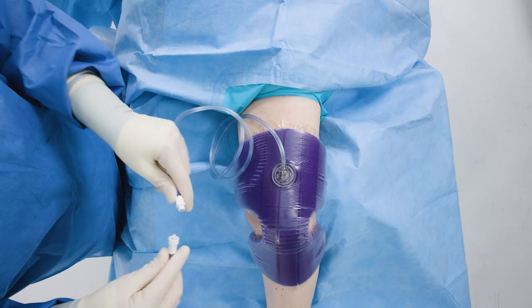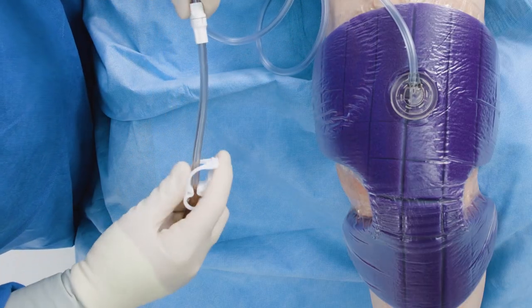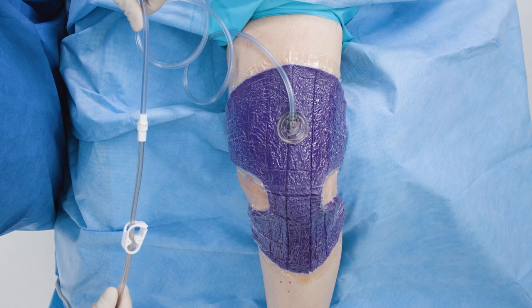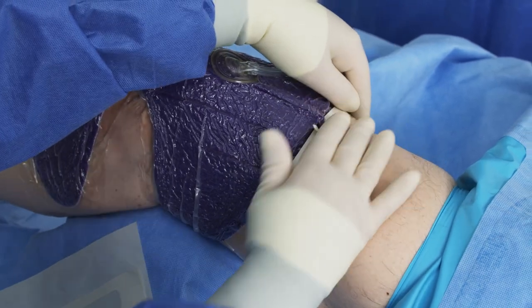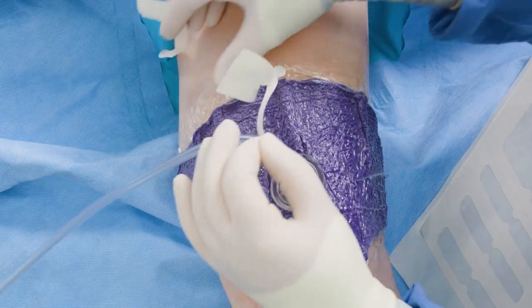With your Praveena dressing properly placed and sealed, you'll be ready to connect the dressing to a 3M negative pressure therapy unit, getting your patient ready for mobile recovery. If there's evidence of a leak, use Praveena patch strips around the dressing to ensure integrity of the seal.